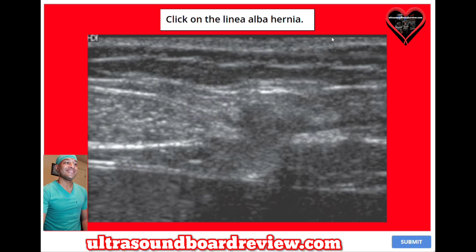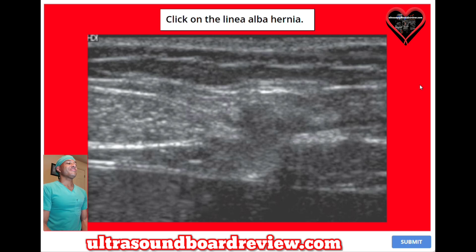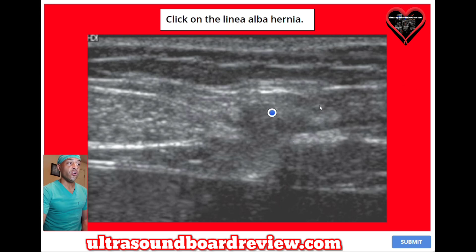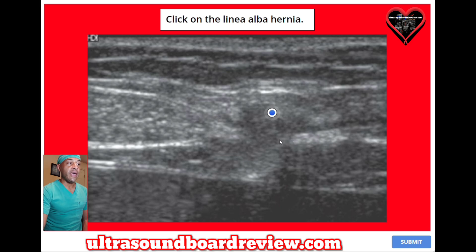Click on the linea alba hernia. The answer is right here. All of this right here is the hernia. This right here is the peritoneal membrane, and this is the linea alba membrane. There's a defect right here and all of the contents right here are spilling into this area. This is the linea alba hernia.